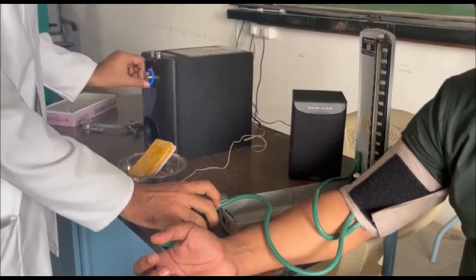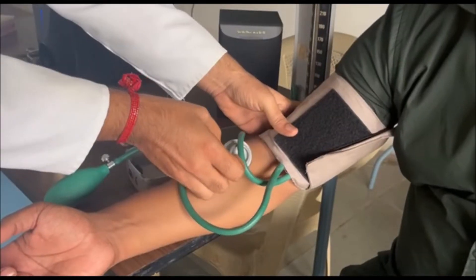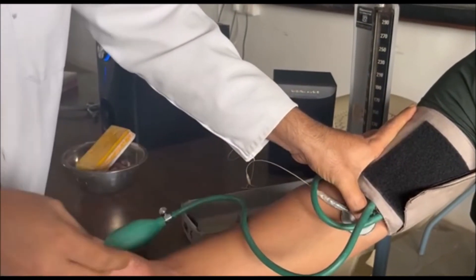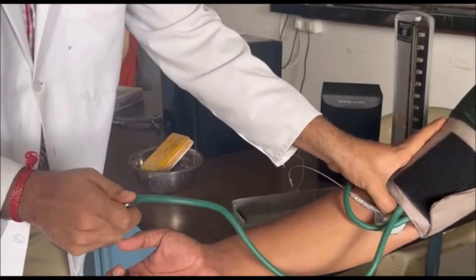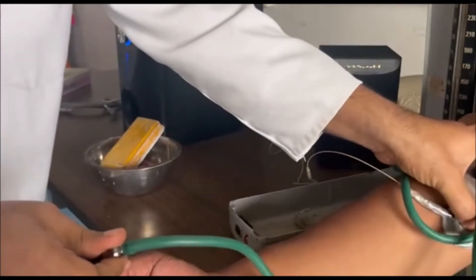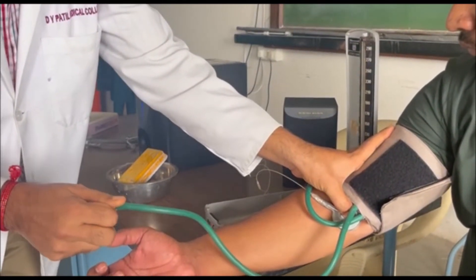Now you can hear the sound — by tapping this sound you can get it. Now systolic and diastolic we are going to record by placing the diaphragm of the stethoscope on this particular brachial artery. Now you can hear the sound — this is the first sound.